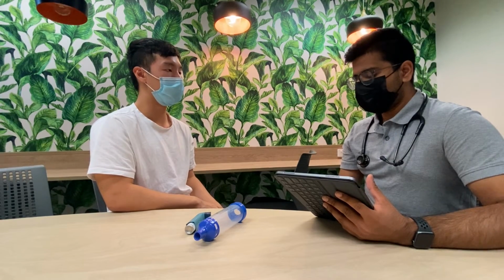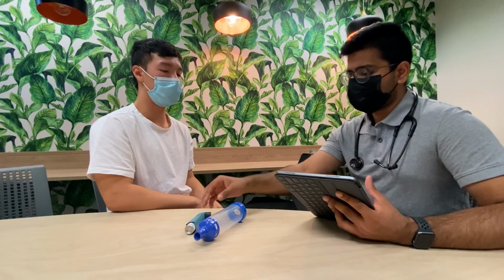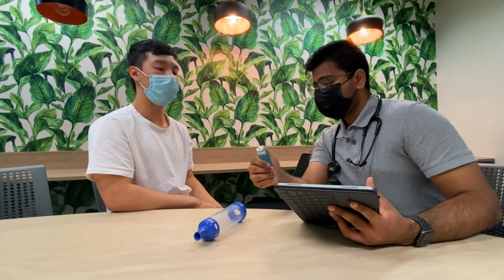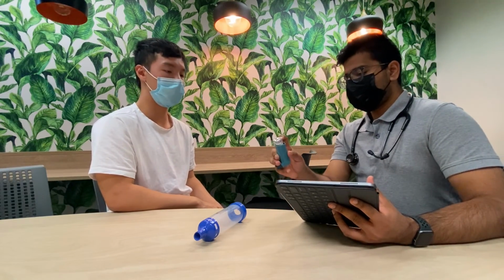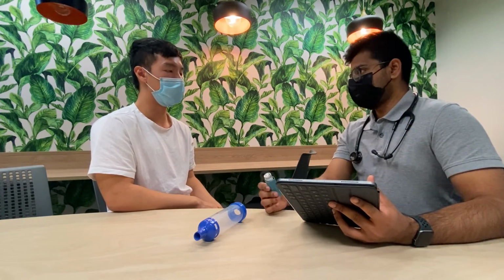Another thing that I would also recommend that you emphasize and remember is, whenever a patient uses this, to often check for the expiry, because an expired medication is probably not going to work as well. So informing them to check the expiry is something that you could do a little bit better the next time.